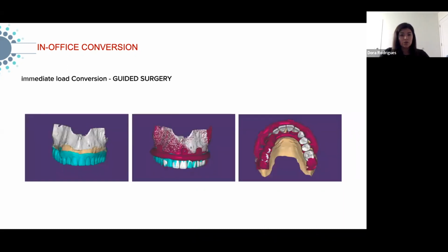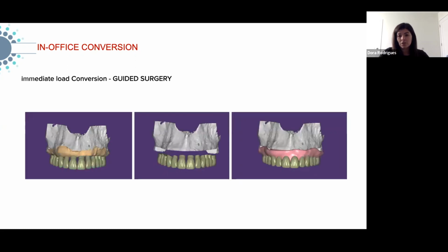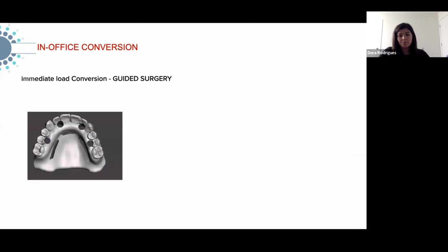And the good thing with the digital is that you can just superimpose all the data. You can get your CBCT, you can get the guide from the doctor, the temporary from the patient, and your proposal of the teeth to make sure that everything lines up and you're not going to have any issues down the road when you're at the surgery. And you can confirm the restorative space and all that.